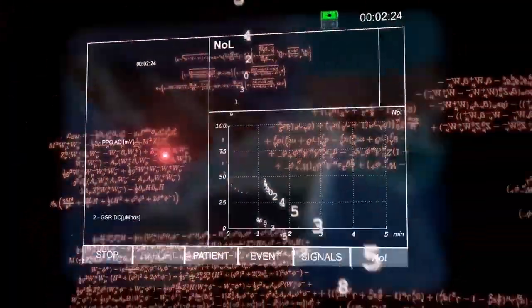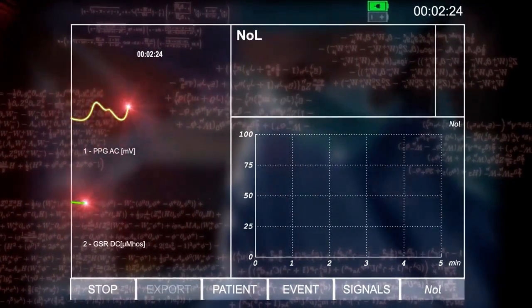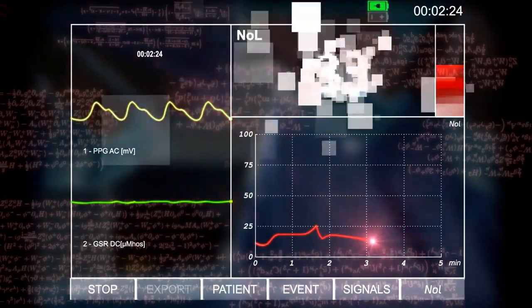Artificial intelligence algorithms and signal processing identify and analyze dozens of measurable changes and reflect the information into a single nociception-level index, the NoL.